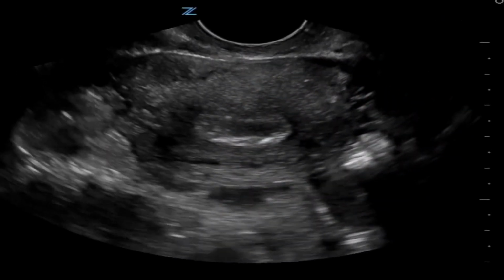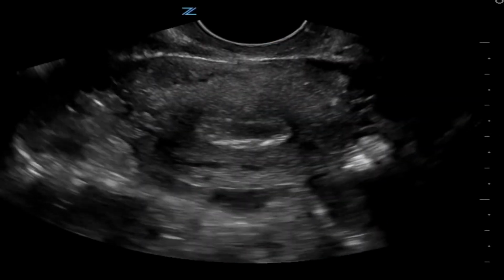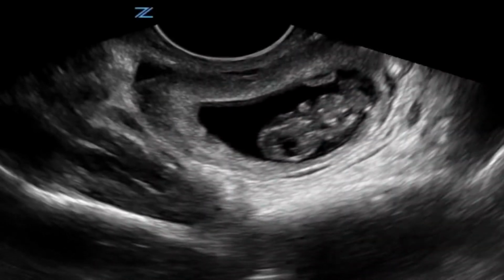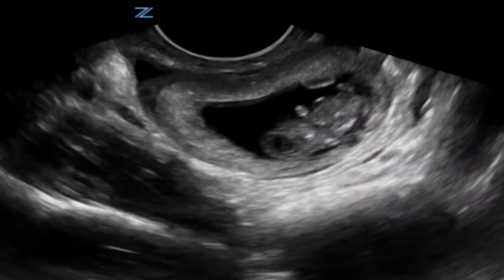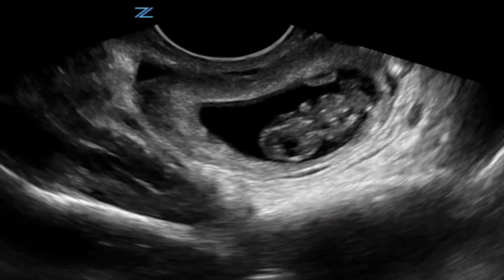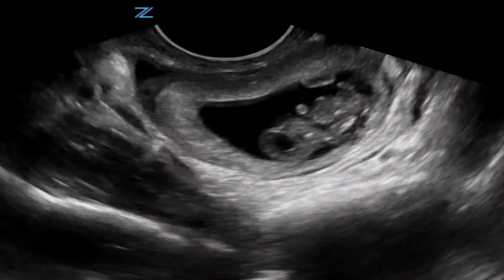This is the coronal view of the uterus. There is no evidence of an intrauterine pregnancy. On closer examination of the ectopic pregnancy, you can see fetal heart motion. So, the patient has 2 IVs placed, she's typed and crossed for blood, and taken to the operating room. So that wraps up first trimester pregnancy.